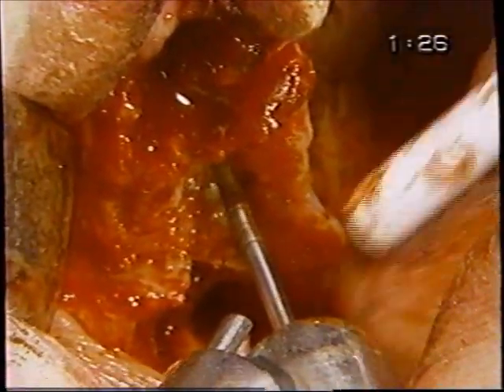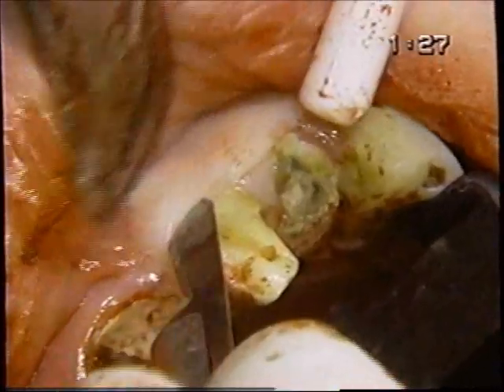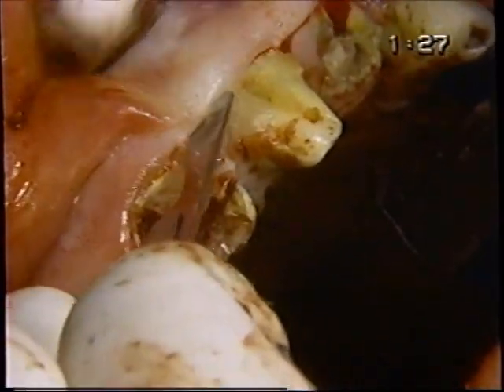What I'm going to do is just remove just enough bone to put the straight elevator around. Okay, that should do it. Now probably a 34, one a little bigger. I think it's moving it into the purchase we made. Now they say that this one is the most common one to go into the sinus. So there we go. Again, papillae removal. We really should deal with this frenum here as well.